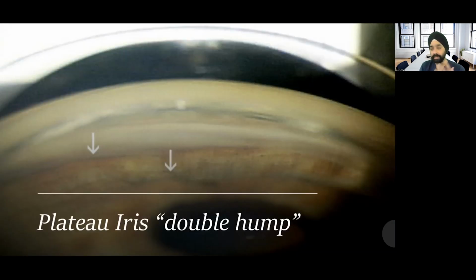So another way to differentiate narrow angle versus, let's say, something called plateau iris is this double hump. You see there's 2 humps. You see this kind of 2-hump system. Plateau iris, again, is an anterior insertion of the iris. And what happens in general is it sits over the ciliary body.